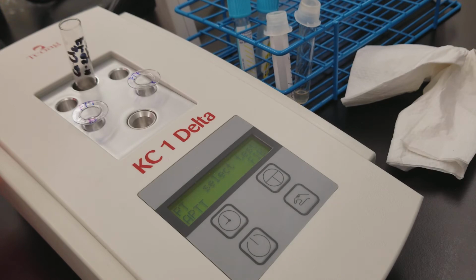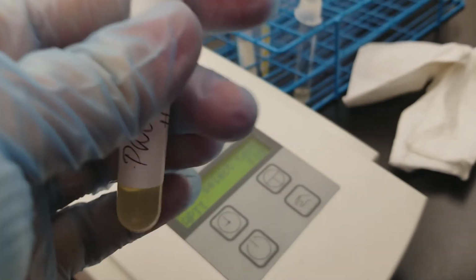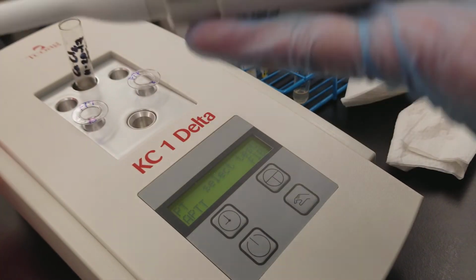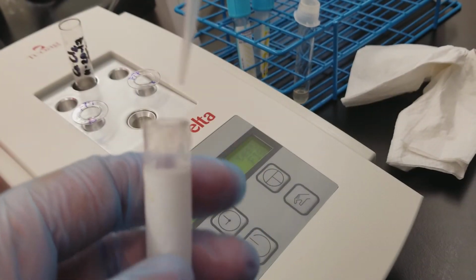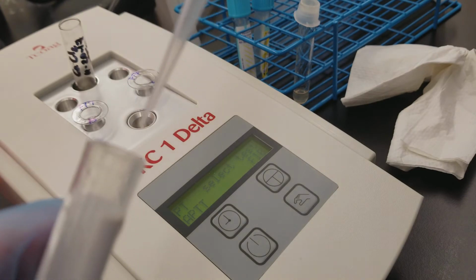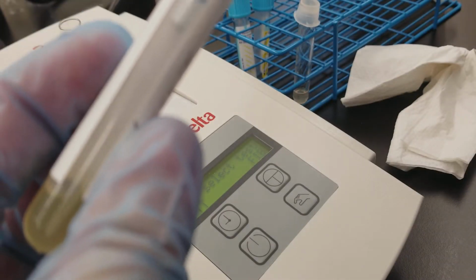Okay, so let's get started. So first we're going to put the patient specimen in there. Again, this is 100 microliters. Whoops, 100 microliters, so you can see that. All right, that's on my pipette. I'm pressing down on the thumb part, and I'm putting it down into the bottom, and whoo, let's see this.